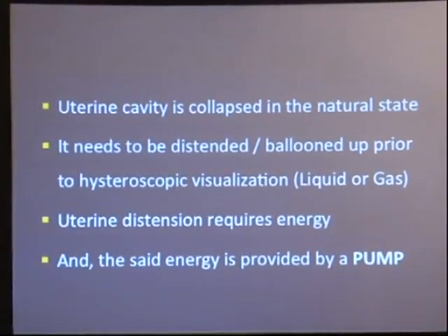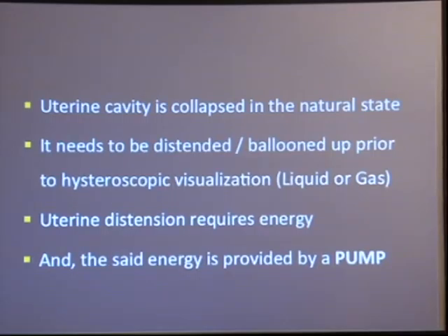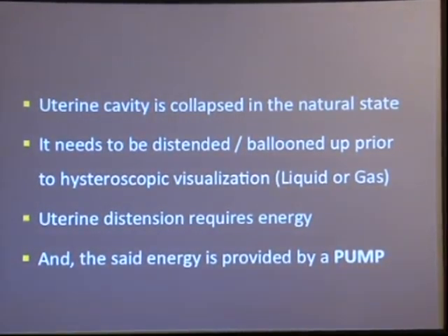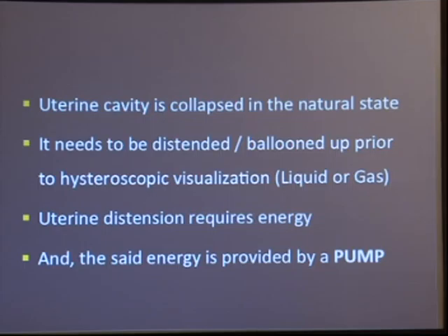You're either going to balloon it out with gases, which used to be the prior art. Now it's almost obsolete, carbon dioxide inflators are not used anymore because the blood always hampers the vision, so you don't get to see so well. So we have moved on to fluid management systems for hysteroscopy, which give distension.